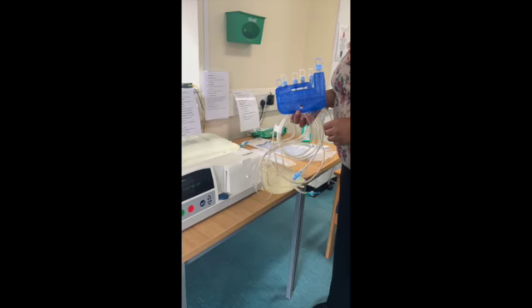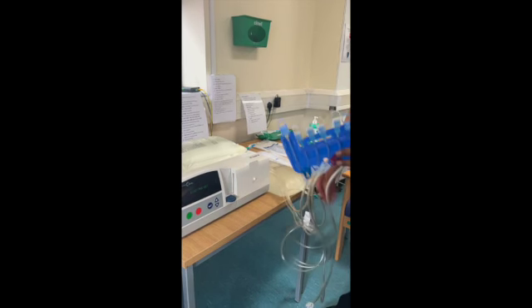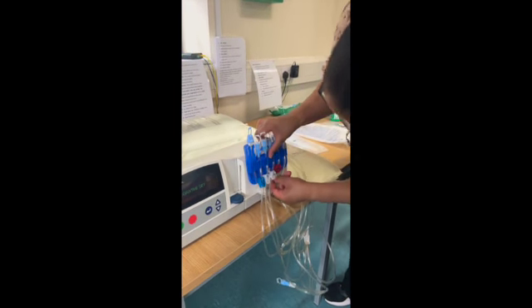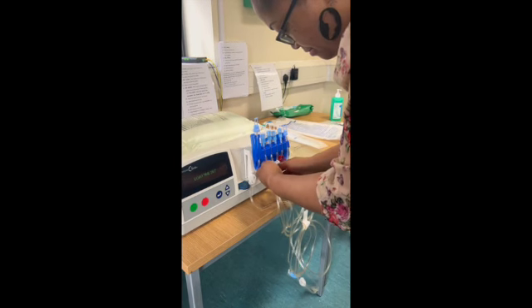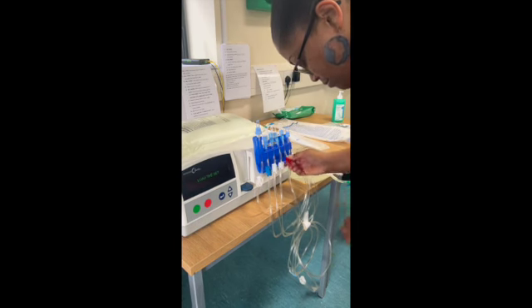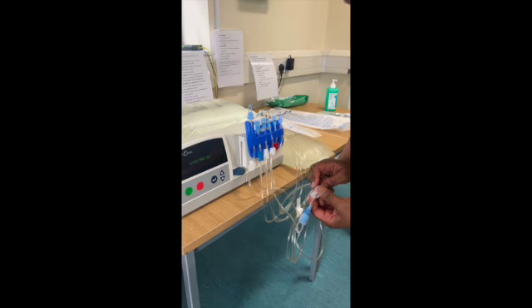So now I'm going to clip the blue organiser onto the machine. So I'm going to turn this around so the wires don't get tangled. Clip it at the top and then snap it onto the next bit. So now I'm going to close the 6 clamps. Now this 6th clamp isn't actually used as part of the process, but I still have to close it.